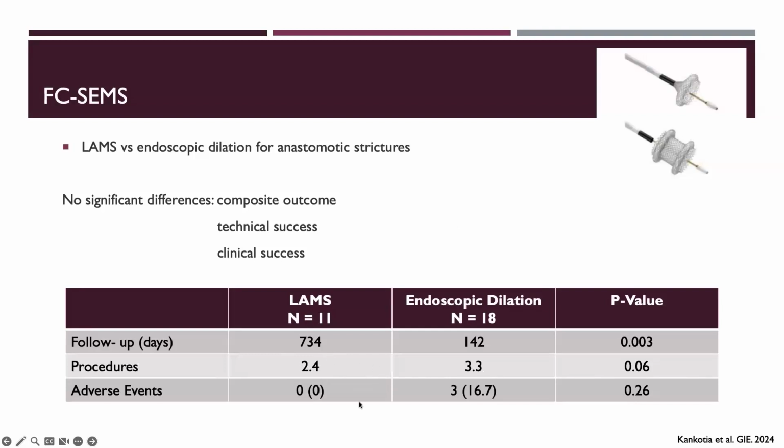But you can also see that the rate of clinical success may show no significant difference, but look at how long those follow-up days were, right? They had the same clinical success rate as compared to an endoscopic dilation, with 700 days of follow-up. So it works quite well. And again, the adverse event rate was 0 here for these patients as compared to 16%, and this is mostly related to bleeding and perforation.